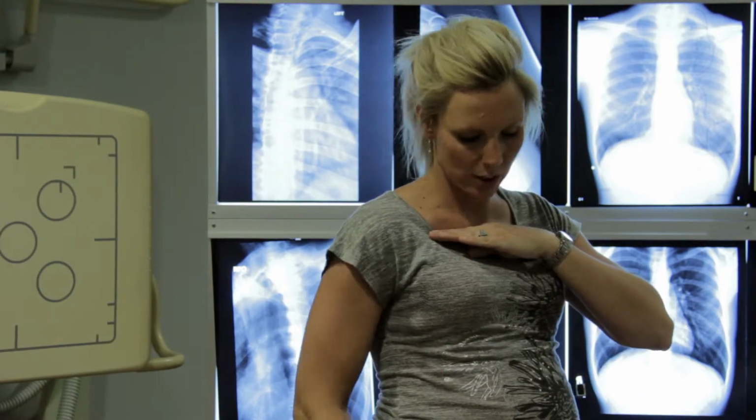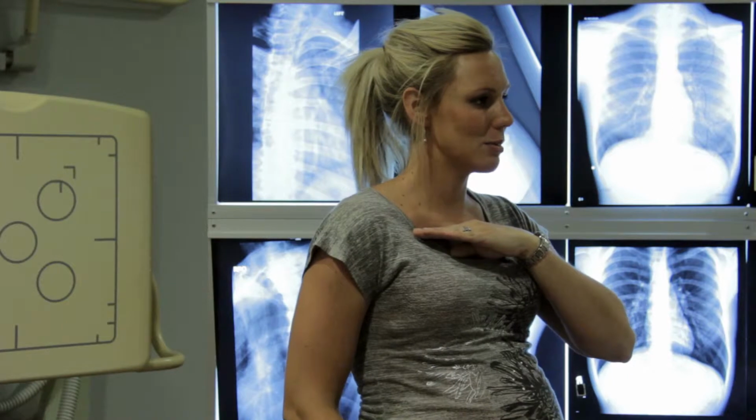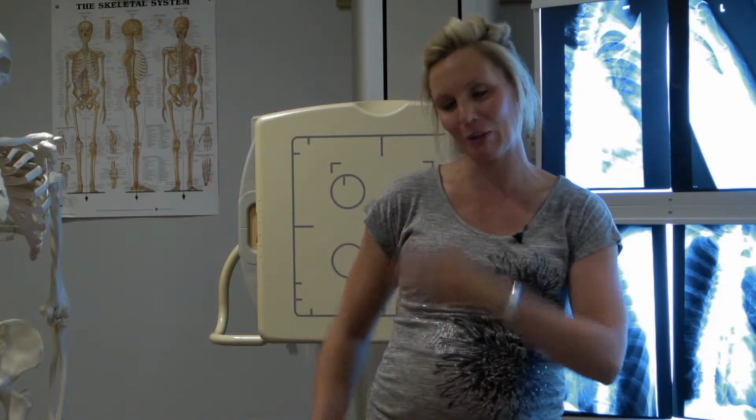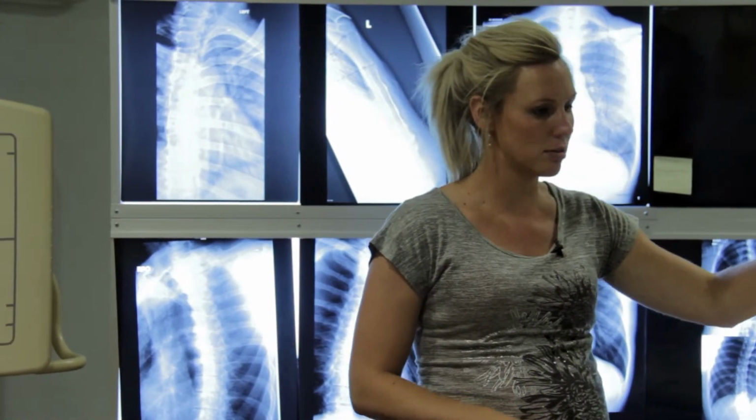Collimate in. If you only need to see ribs 8 through 12, am I going to have light field here and light field halfway down my crest? Probably not. Probably don't really need it that far. If we see crest on your rib pictures, you're not collimating appropriately. So kind of, you know, collimate up. Now we know where lower rib margin is, and we know where xiphoid is. So we know kind of centering, we know collimation. But those will all be done on their backs.